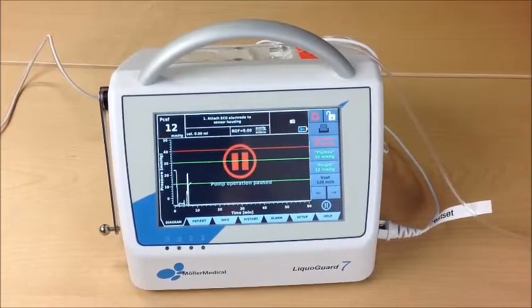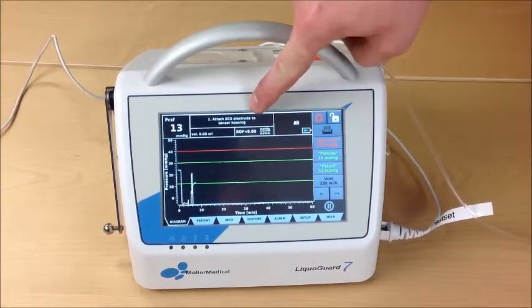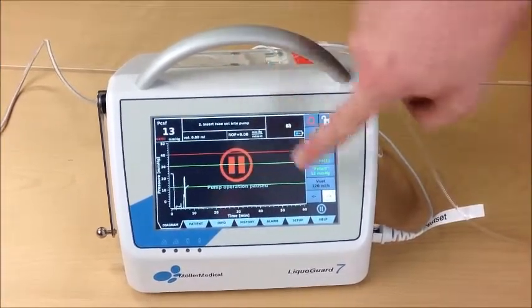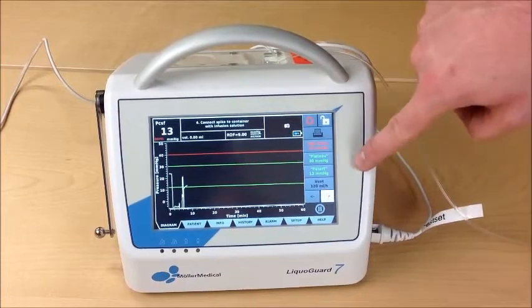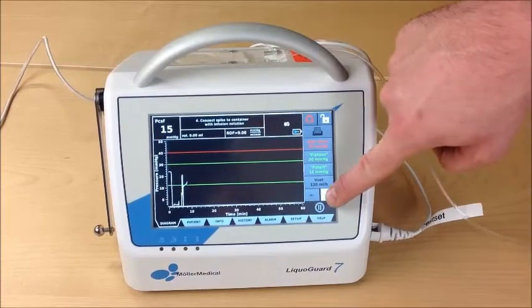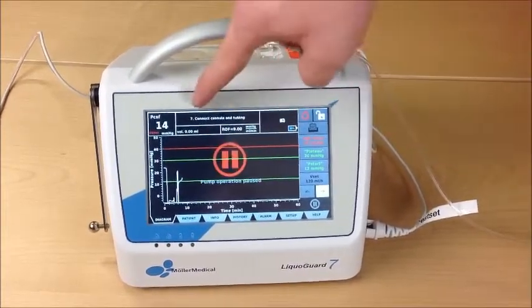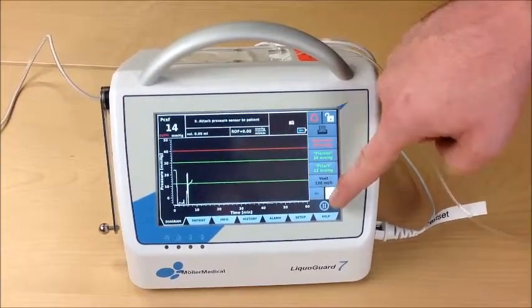The easiest way is to follow the instructions given on the machine. The steps include: attaching the ECG electrode, inserting the tube set into the pump, connecting the sensor cable to the device, connecting the spike to a container with saline solution, filling the tube set until completely full, puncturing the patient, connecting the cannula and tubing, and attaching the pressure sensor to the patient — all of which we have already completed.